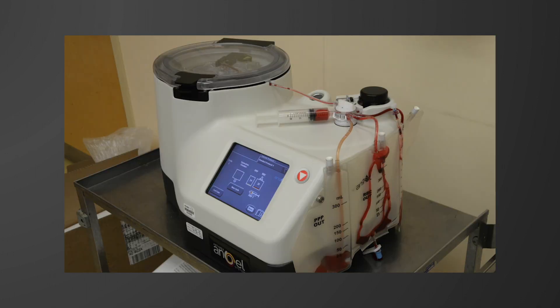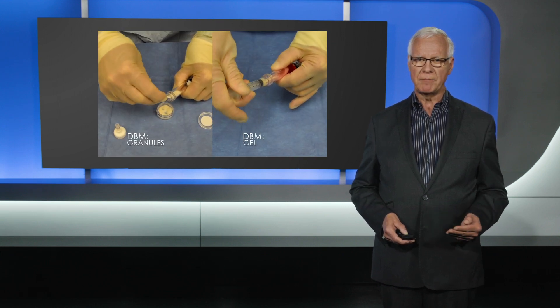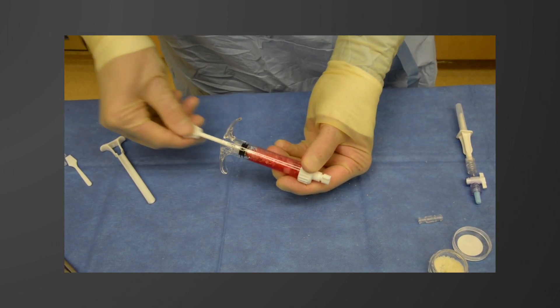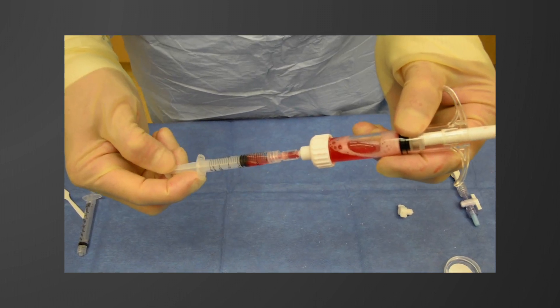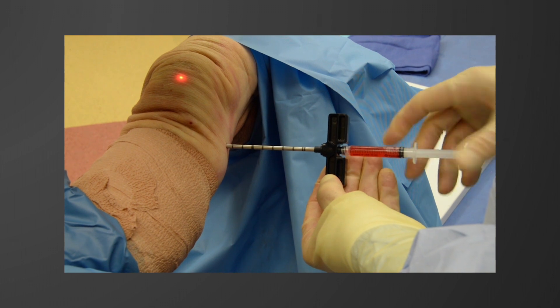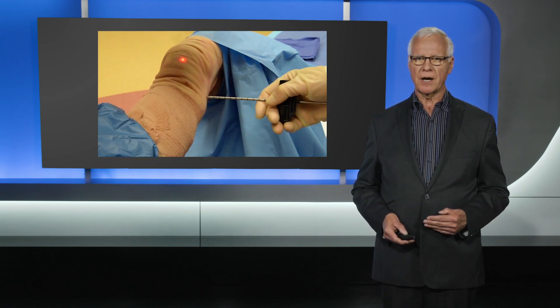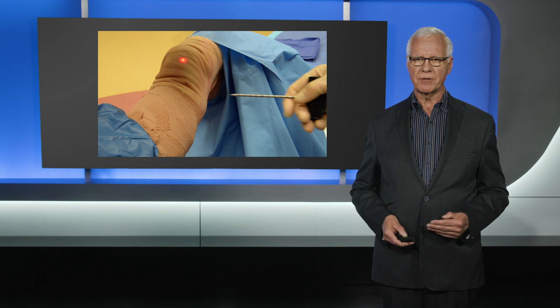I'm making sure that it's cleared. During this time, my technician is adequately prepared — adding DBM granules or gel and then mixing this thoroughly so I have a nice consistency to be able to inject. This is just one of the techniques for mixing. It's really important to mix it very thoroughly, otherwise it will clog up in the cannula as you're trying to inject. Typically we obtain four to five milliliters total, and then this is injected. This is a little dilute because this is an example. Typically I have a little more difficulty and will have to reinsert the obturator multiple times during the injection. This is repeated both at the tibial plateau and then up to the femur in a similar technique.